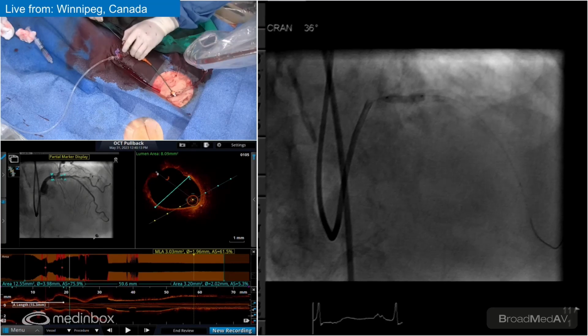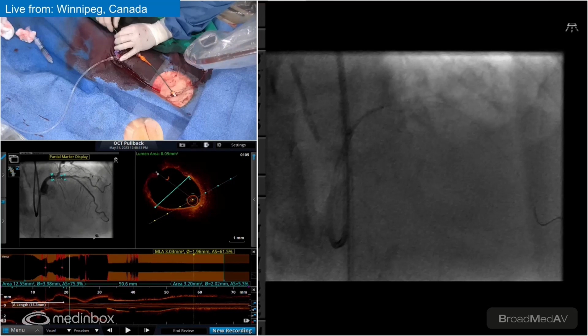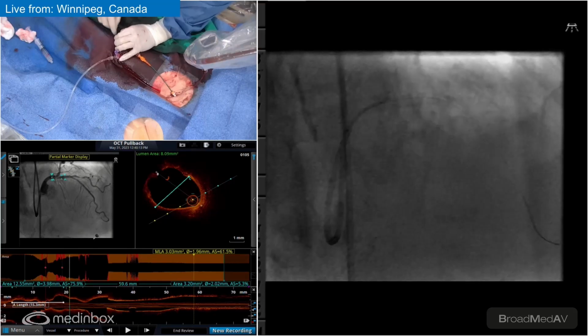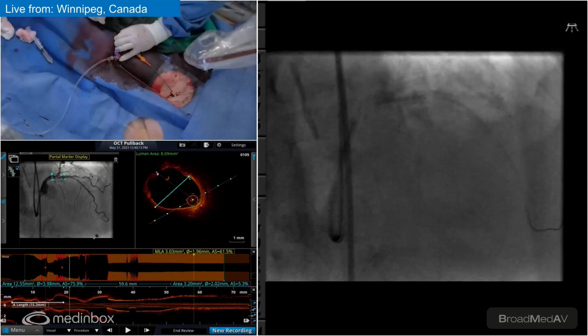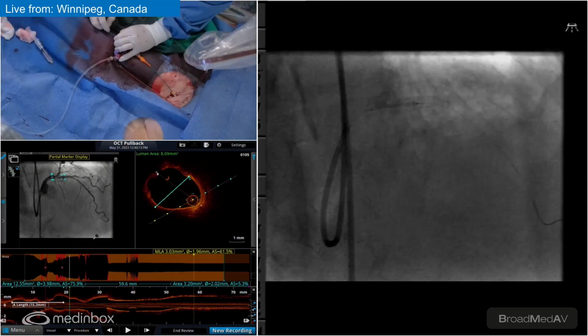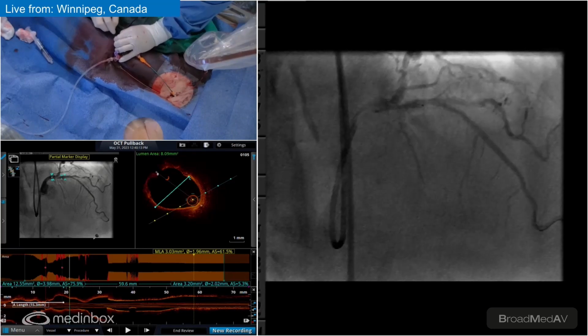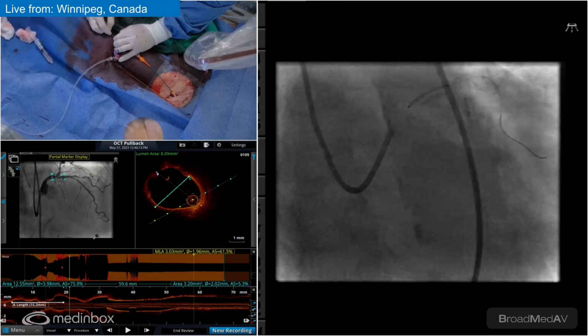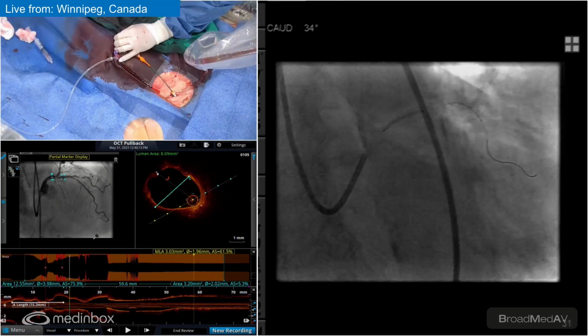getting a bit more conscious. We'll look at the, there we go. A little puff there, please. I want to make sure we're hitting it right at the spot. Yeah, your distal's good. A little puff again, please. Should we do caudal? Yeah, have a look at the proximal. A little test there. Brilliant. That's pretty good. Yeah, it's brilliant. I think it's a go.